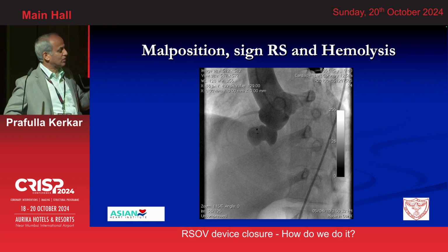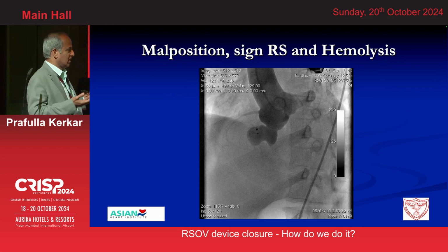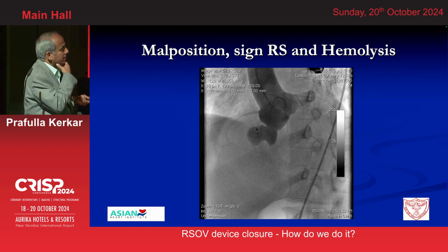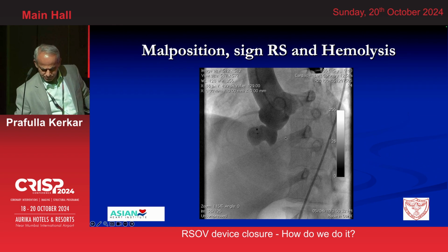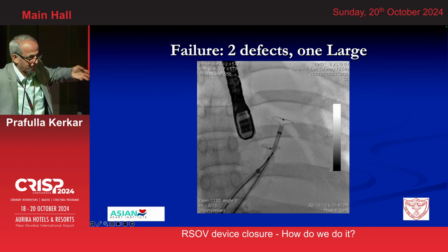But what I'm trying to tell you is that the exit point is very flimsy edge-wise, if at all the aortic end is stouter. In this angiogram, you can see one more exit point. Do you agree with me or not? Now here, we should not have ever attempted it. This is one of our failures.